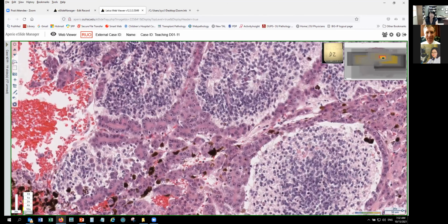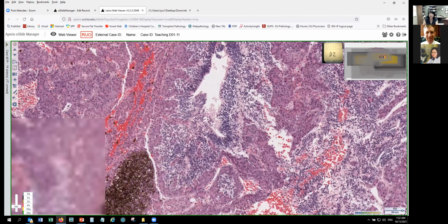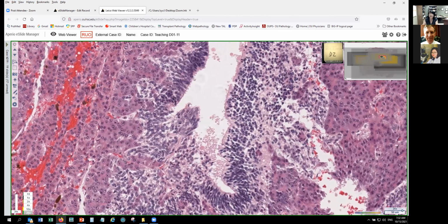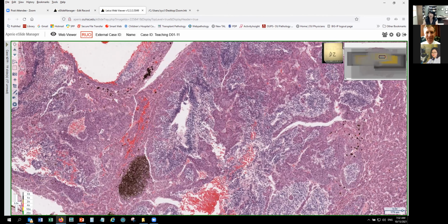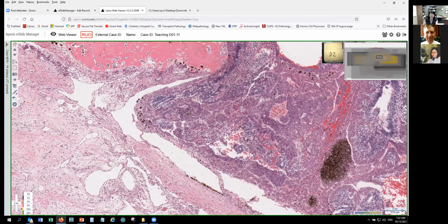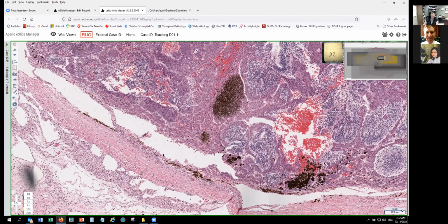And it's better when you go to this area. Actually, you have neural tube here, immature neural tube, lined by epithelium that looks ciliated. And this is like immature neuroblasts. So with this feature, we call it teratoid feature. So now with this case, we have a fetal type, some area we have embryonal type, and you have mesenchymal. That's for D2.